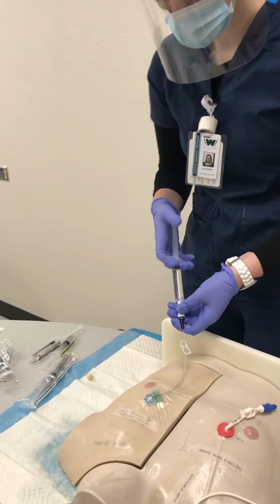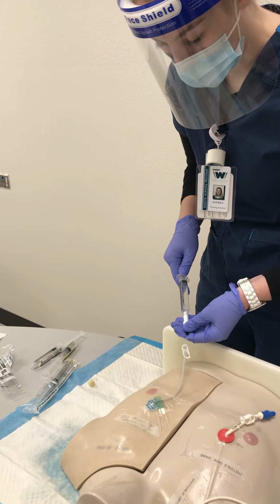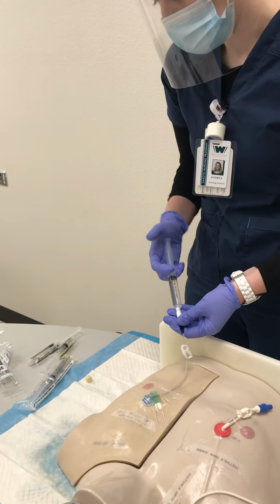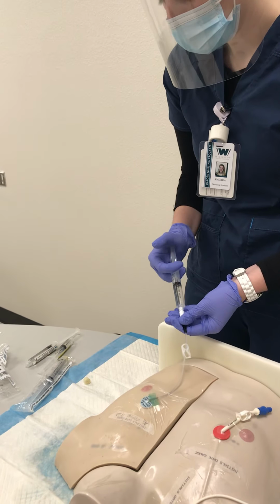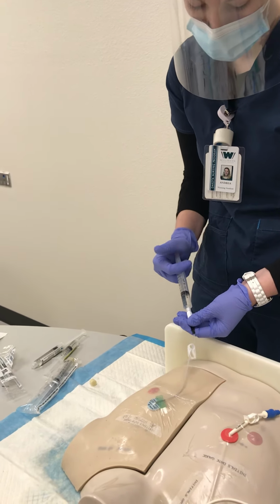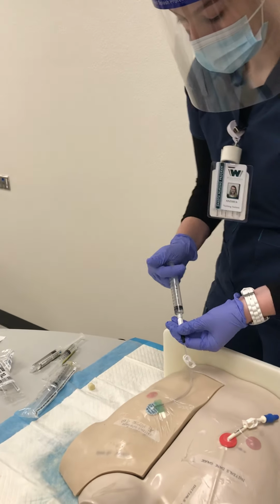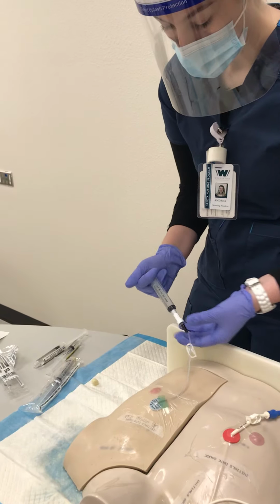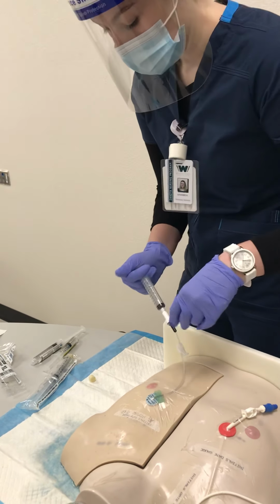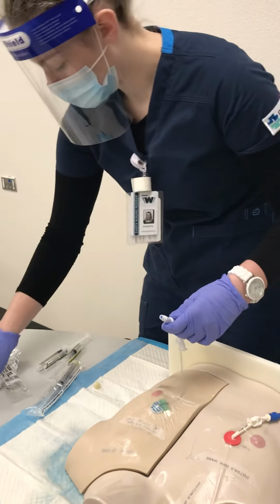unclamp my tubing. So I'm going to aspirate to make sure that I see a blood return, make sure the line is still patent, and it is. I see some blood coming back, and now I can do a push-pause method. So while this is still hooked, I'm going to lock that, keep my hands on the plunger, and then unhook this. And now I have my ceftriaxone to give.